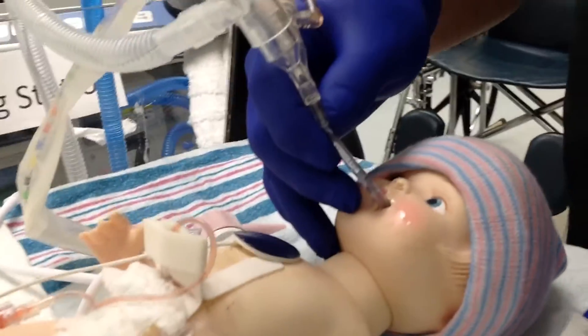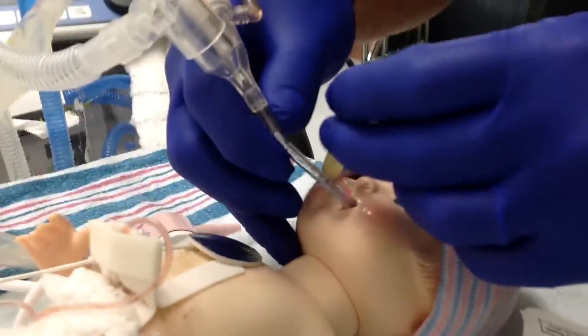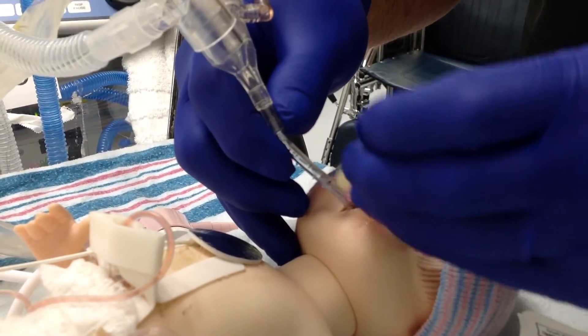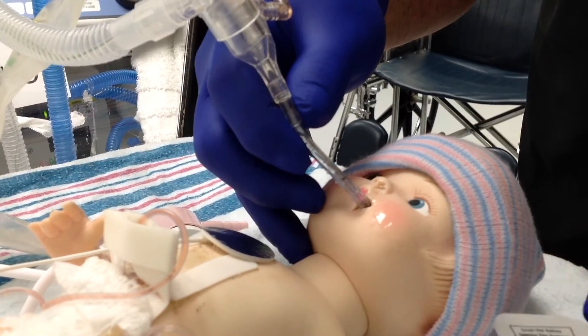You then want to wipe the baby's face clean of any secretions. Wipe your mastosol along the baby's top lip, around the tube, and down the cheek.